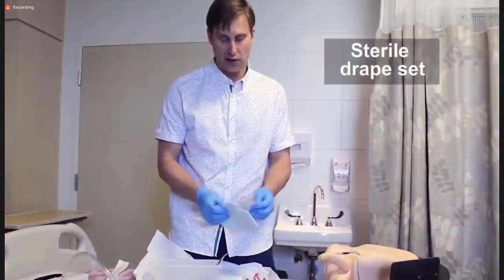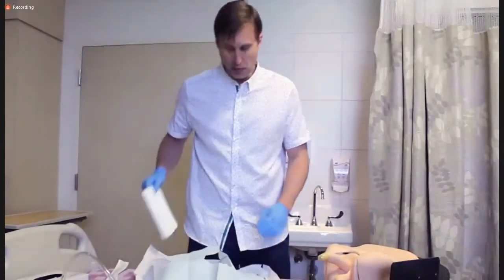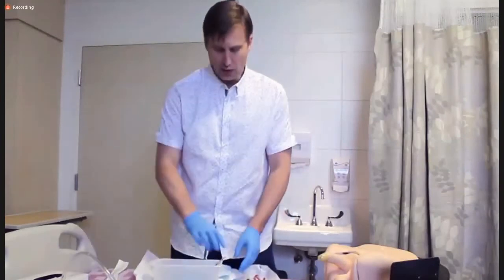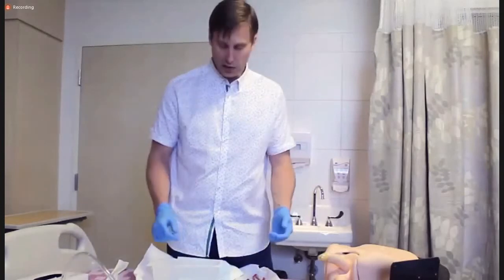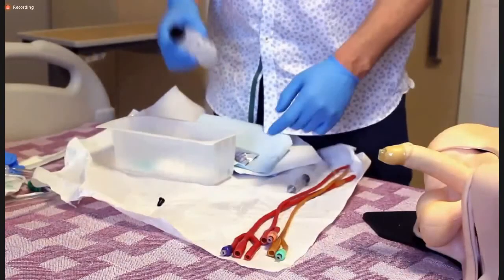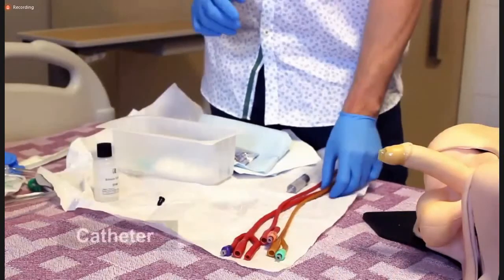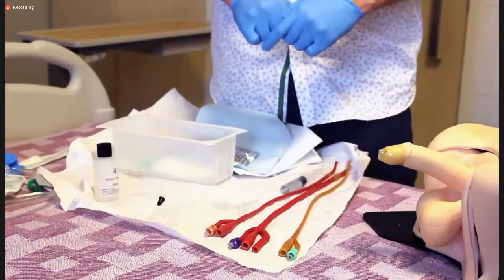Most catheterization kits will come with a sterile drape, usually in 2 parts. Once you have your sterile drape, you'll also need your cleaning solution. In this case, it's a betadine solution. You'll also need lubrication, usually some form of jelly lubricant or other various forms. You will also, of course, need your catheter, and they come in various forms, and we'll review each of those near the end of the video.